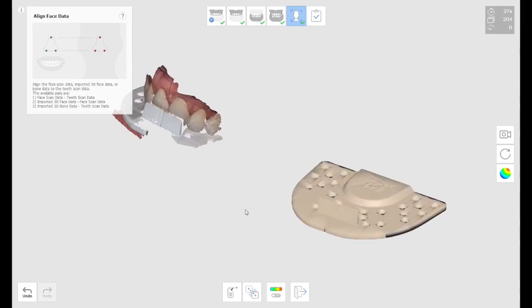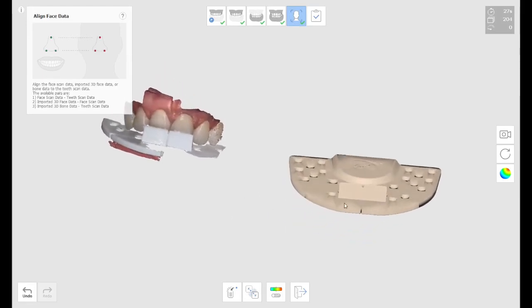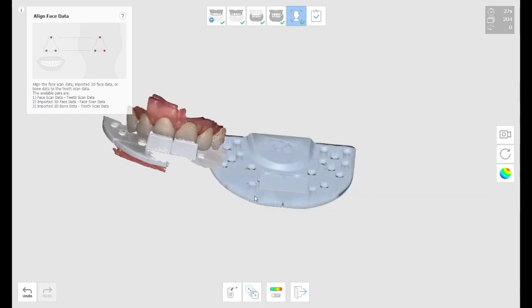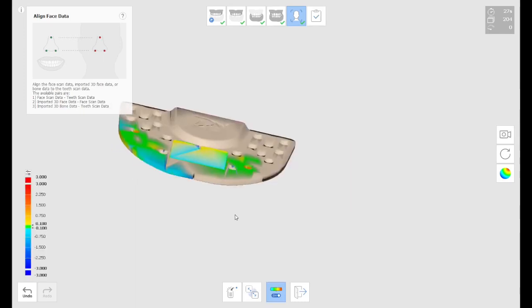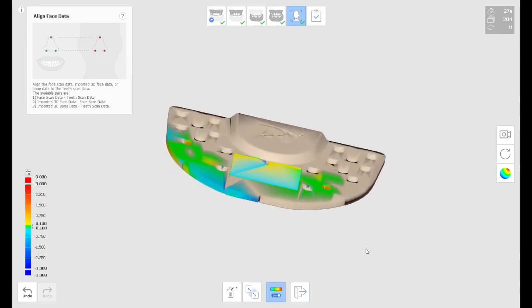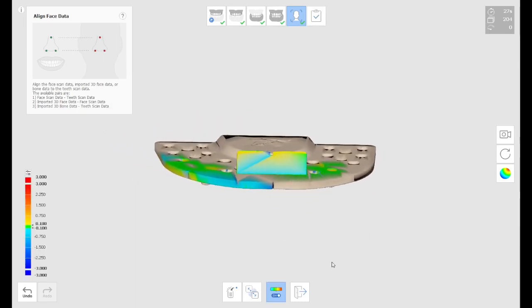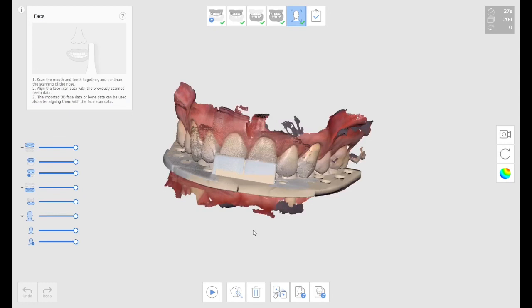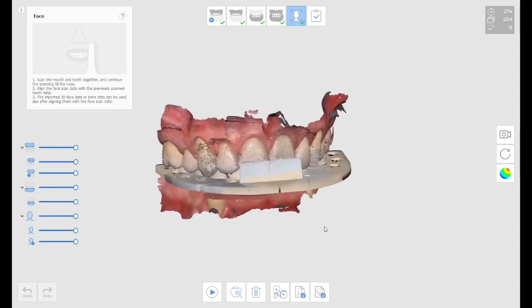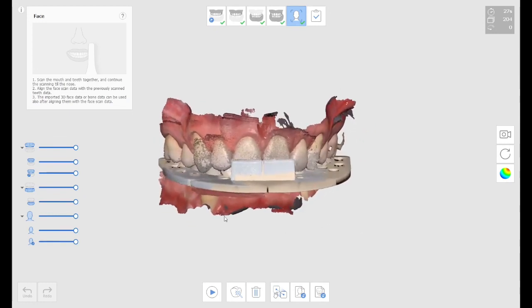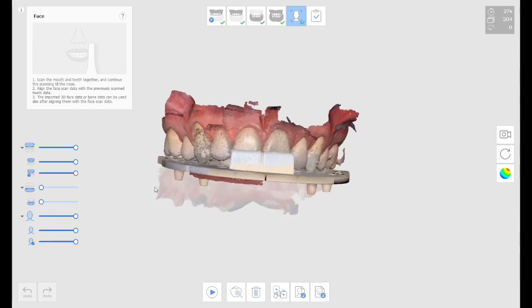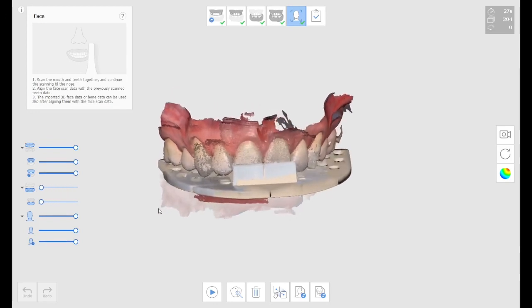That way, I'm going to select two points, again, one on the STL, and then the other one on the actual scan. And then you can see how everything becomes aligned. So I just need to scan a little bit of that index tray in the mouth to be able to align the whole file.